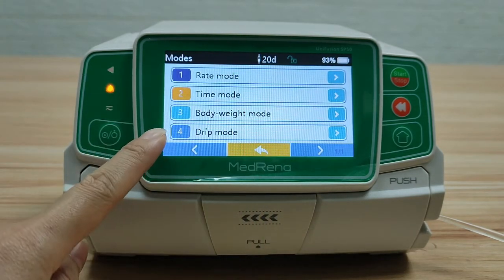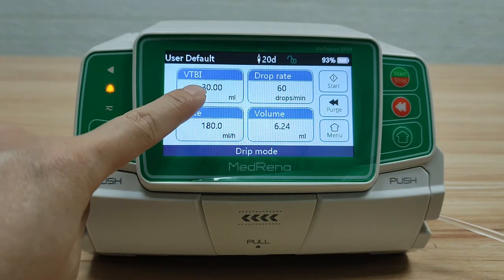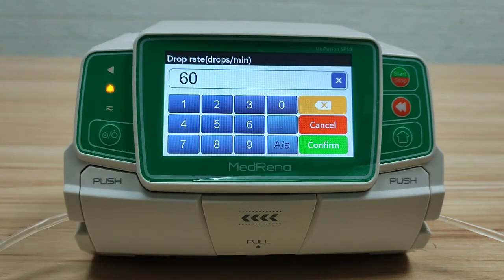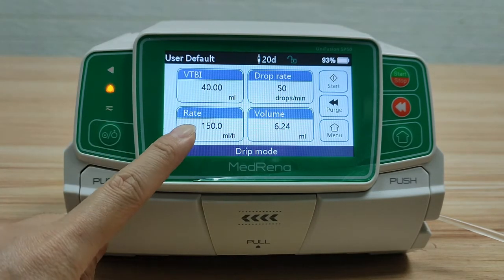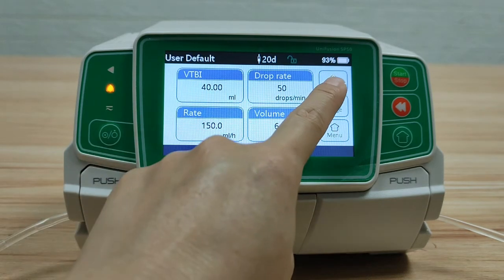The fourth mode is Drip Mode. In this mode, enter the volume to be infused and the drop rate — for example, 50 drops per minute. The pump automatically calculates the infusion rate. Then start infusion.